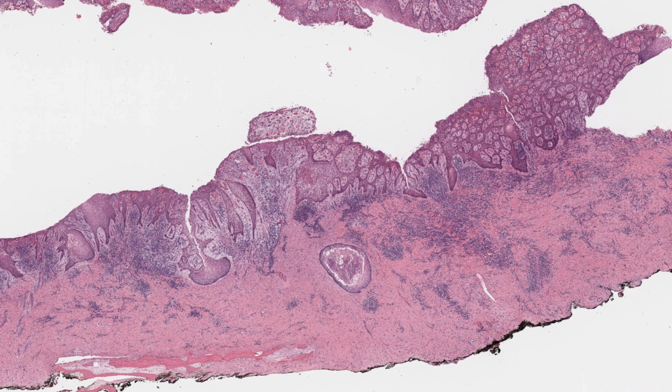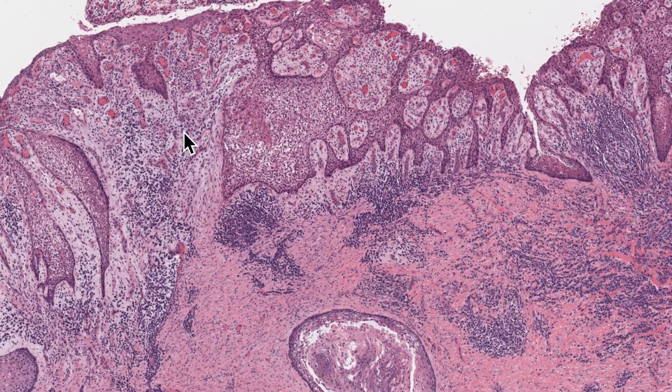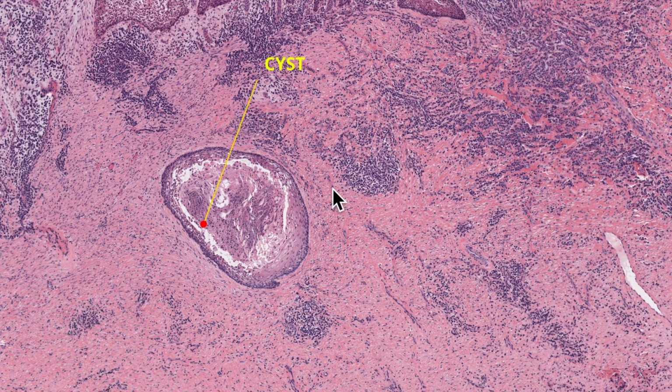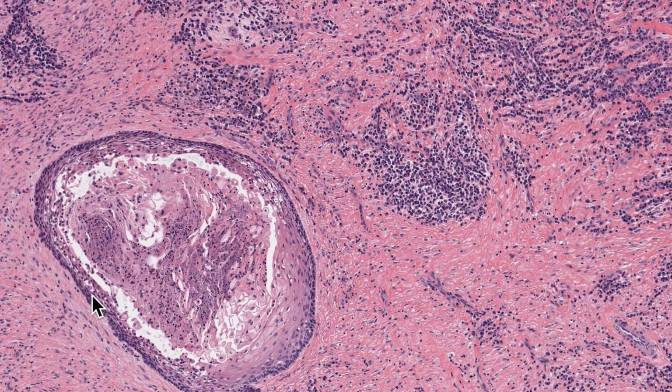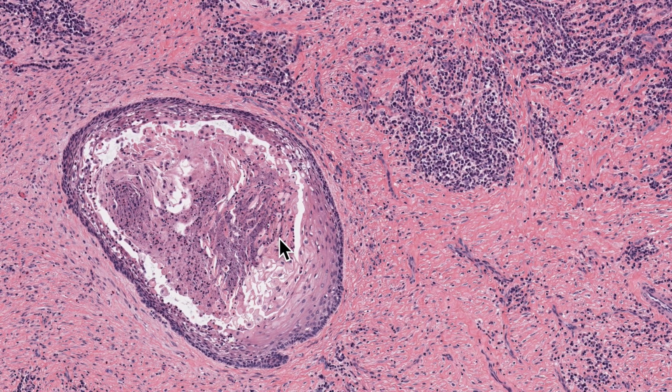Odontogenic keratocysts are known to have daughter cysts. Now, what are these daughter cysts? If you keenly observe the connective tissue capsule of an odontogenic keratocyst, there are epithelial islands, and this is one such example. This epithelial island shows central keratinization with lumen formation. So this is a very good example of a daughter cyst: an epithelial island with central keratinization, the cells producing a lot of keratin, and at the same time an epithelial lining with a lumen. This forms a tiny daughter cyst, and this is one of the most important reasons why this keratocyst has a high recurrence rate.